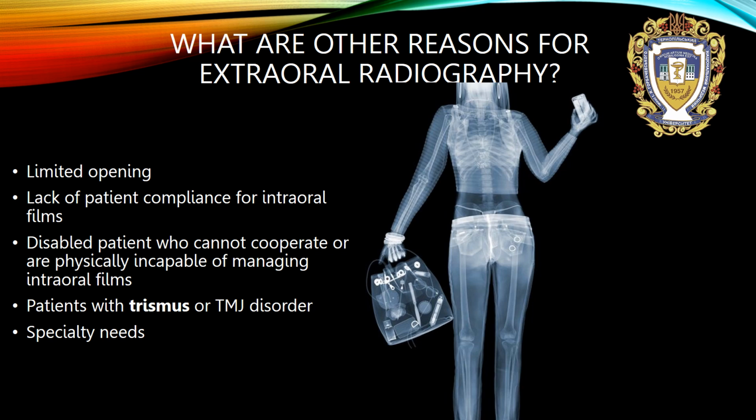Lack of patient compliance for intraoral films, for example, high vomiting reaction. Disabled patients who cannot cooperate or are physically incapable of managing intraoral films. Patients with trismus or TMJ disorder. And specialty needs.